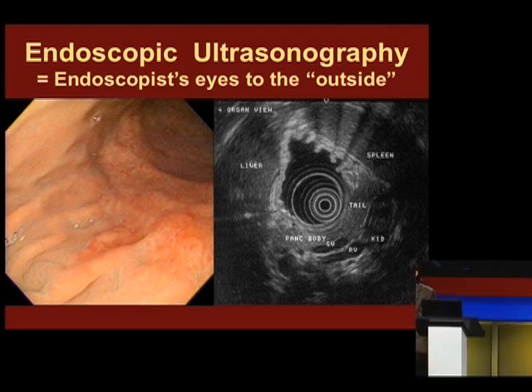And it's really against this background that I want you to understand why we, the interventional endoscopists, have started to look back at our own roots. Actually look into our own backyard rather than the surgeon's backyard. See, endoscopic ultrasonography has been with us since the 1980s. It's our eyes to see the outside world. We have been visualizing all of the organs around us for decades.